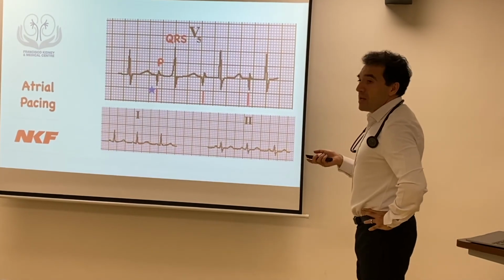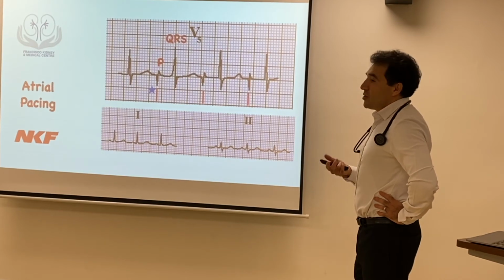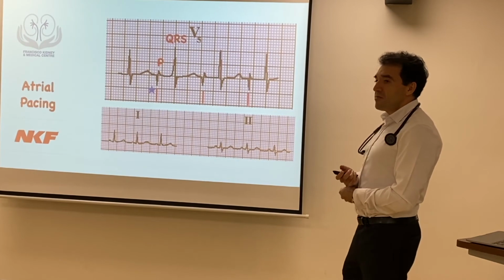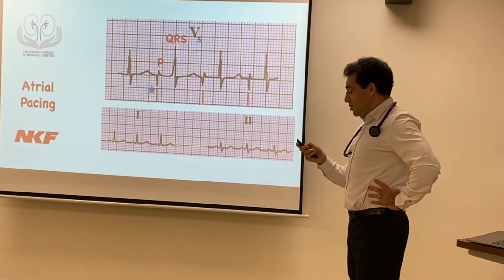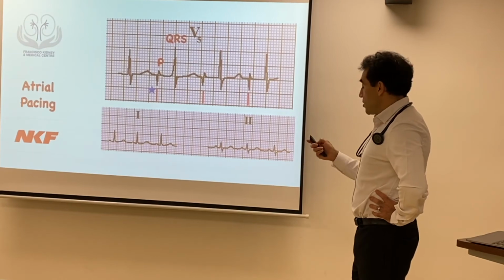Okay, many people have atrial pacemakers. So why is it important? Because you can identify that the patient has a pacemaker. You can identify that the patient is symptomatic and has a pacemaker, or maybe you don't see the pacemaker spike, so you need to flag it to the doctors, and that could be the reason why: the pacemaker is not working.